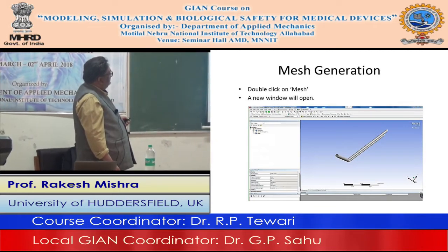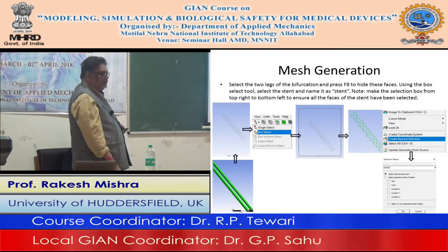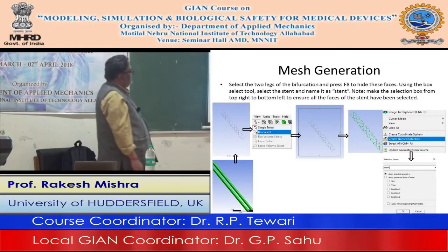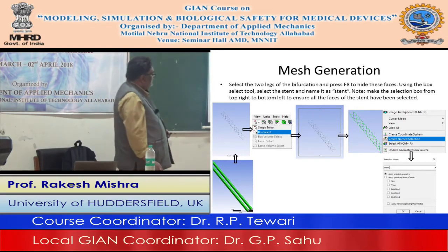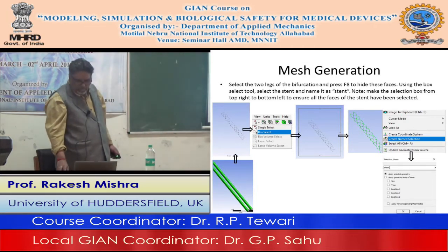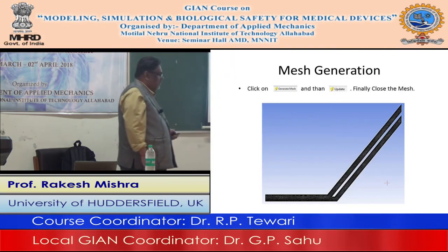hide them, and then using the box select tool we select the stent and name it as a stent. So only the stent part has been named as a stent, not the arterial part. We have hidden those, and then the arteries we can name as wall. So then stent is created, walls are created, okay, and then we create mesh. So again, mesh creation is a very important part of the CFD. You have to have the right mesh to get good results. So I've given some values here for the mesh sizing, and if we did that, we get a reasonable mesh which we can generate and update. You have had experience of this yesterday on a single artery, okay, single artery.